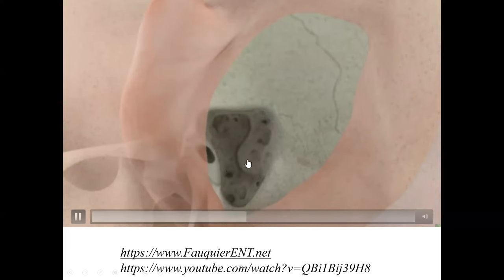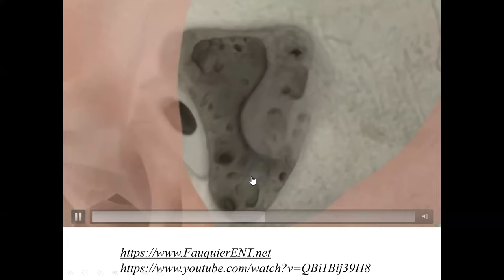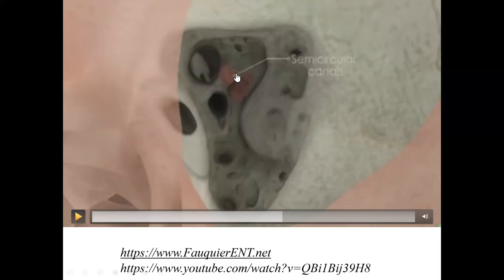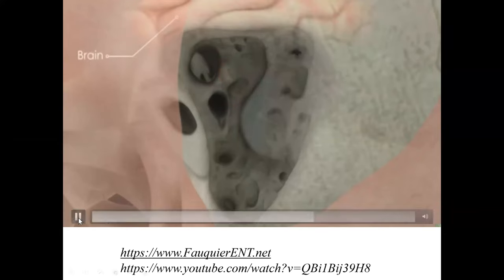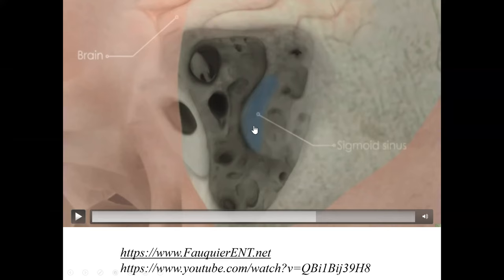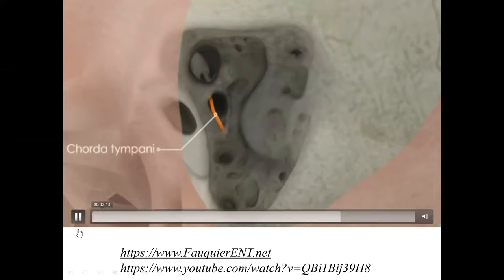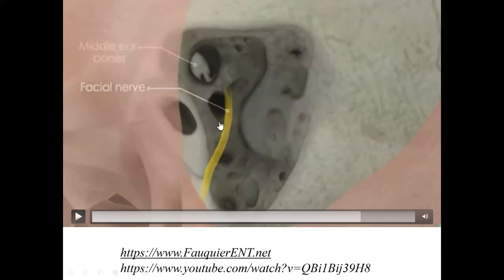The surgeons continue to drill through the mastoid air cells, and eventually deep to those cells is the middle ear cavity. Here we can see the surgeons have drilled into the middle ear cavity. The epitympanum is visible superiorly and the middle ear cavity is more inferior. The incus buttress is identified here, which we'll discuss in cross-sectional imaging. The area in red identifies the semicircular canals. The brain is above the tegmen tympani, and the sigmoid sinus is also visible — the surgeons do not want to injure either. There's also the chorda tympani and the facial nerve in this surgical view.